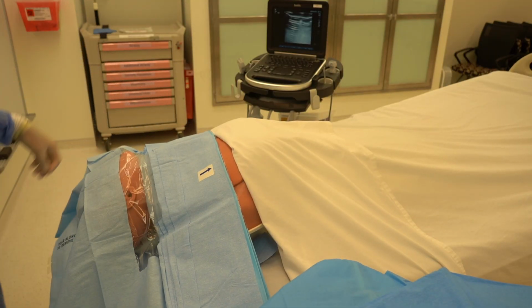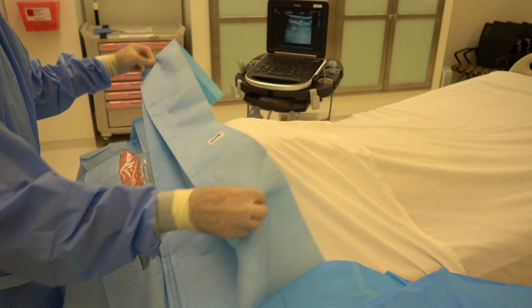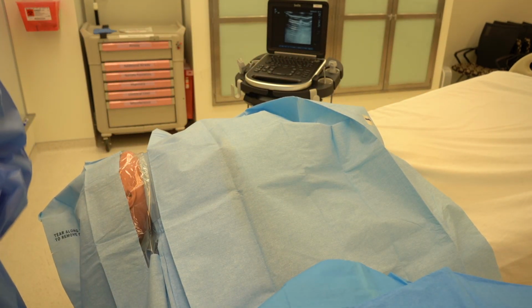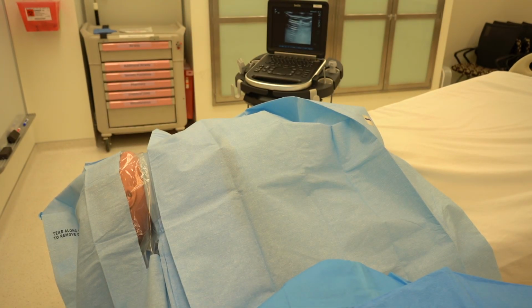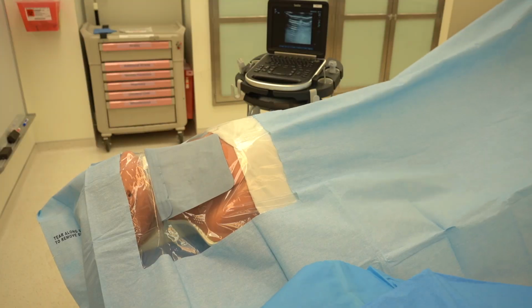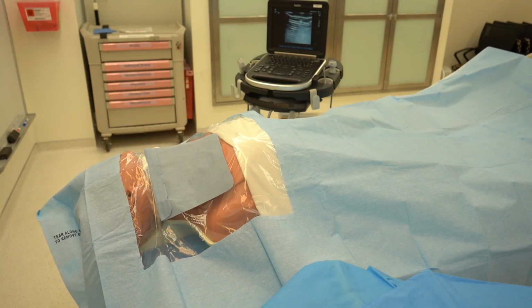And as we're proceeding here, we're going to pull the rest to the foot of the bed to get full coverage of our patient. Typically, we'll have an assistant to help with some of this, but certainly something you can do independently. Just try to maintain sterility throughout.